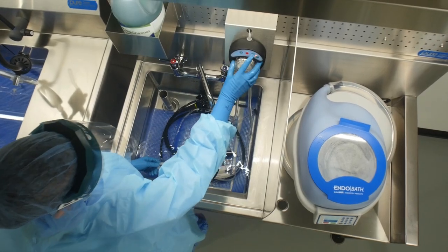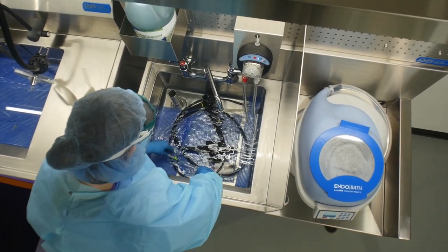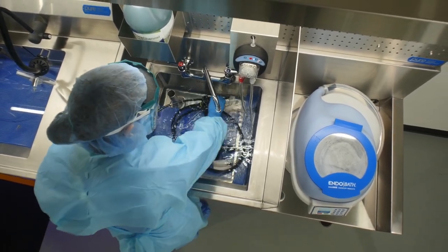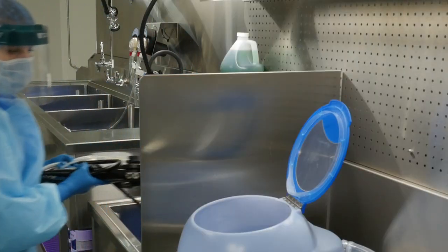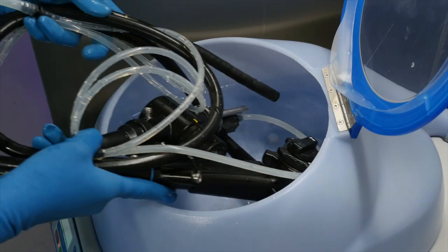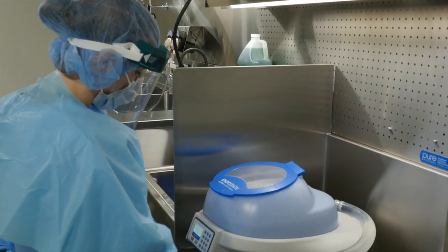PureSteel task lights help illuminate and magnify small parts for external inspection. The PureSteel HLD sink allows technicians to perform side-by-side functions while separating dirty from clean items to prevent cross-contamination. The design provides counter space for the EndoBath disinfection device and allows for easy drainage of HLD solutions without exposure to fumes.